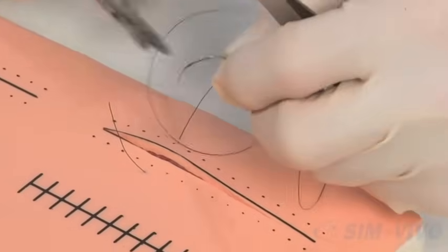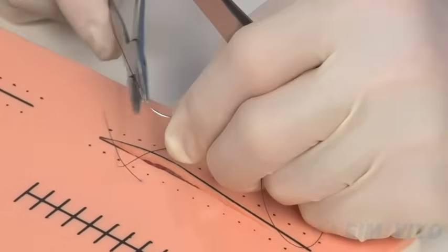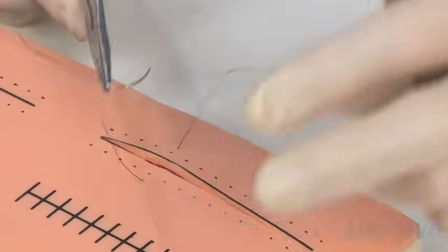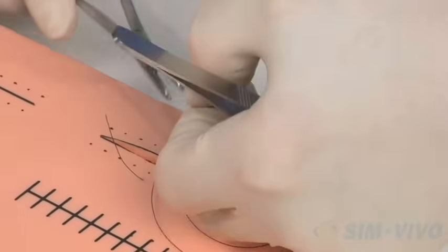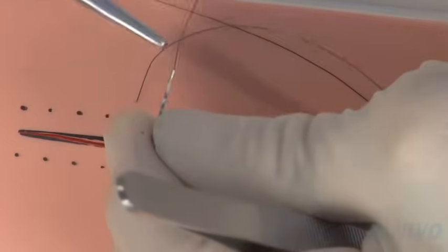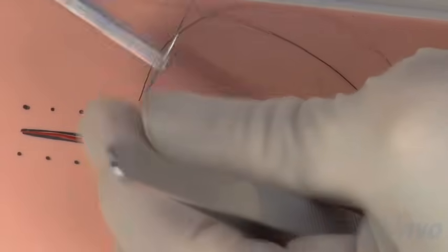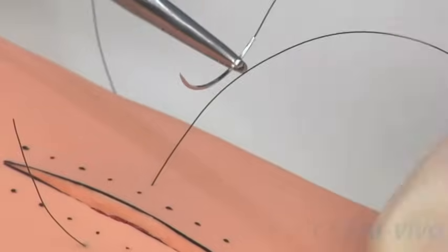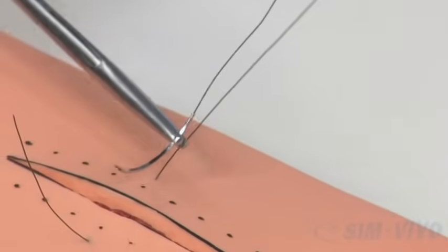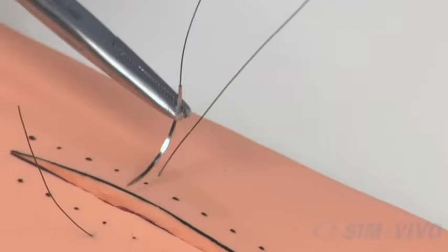Now we're going to do things a little differently. Rather than load our needle in the regular forehand fashion, you're going to load it backwards in the backhand fashion. So the needle will be going in the opposite direction from the usual way of loading the needle, so you can put it in the skin to re-approximate that.